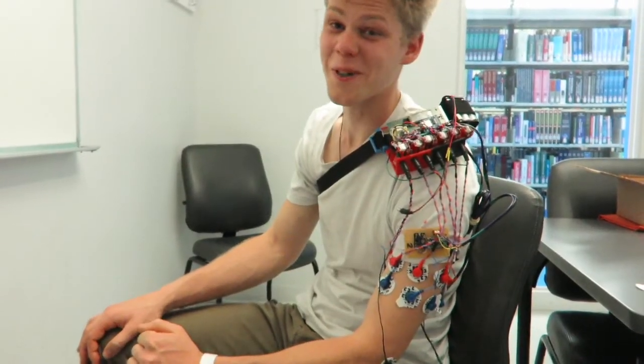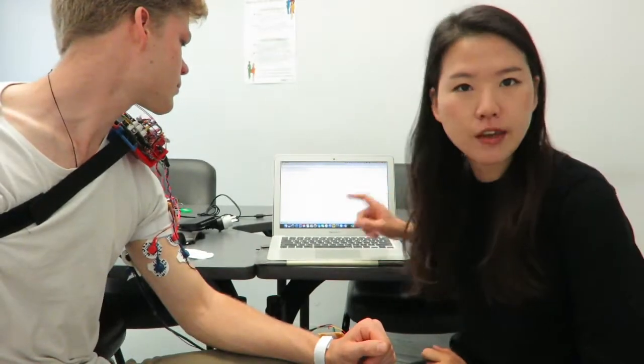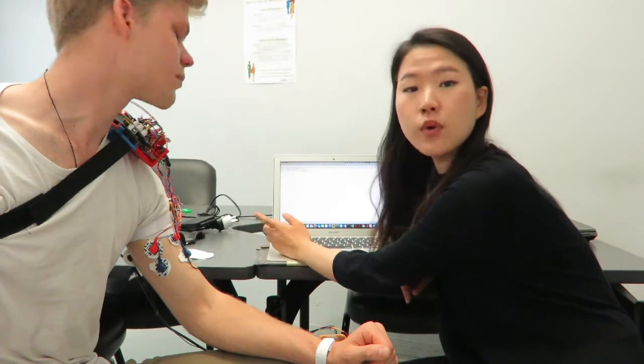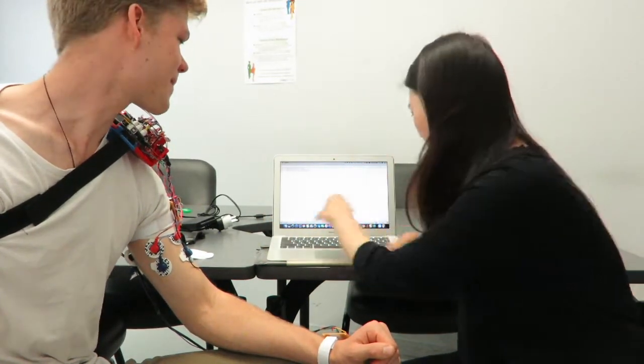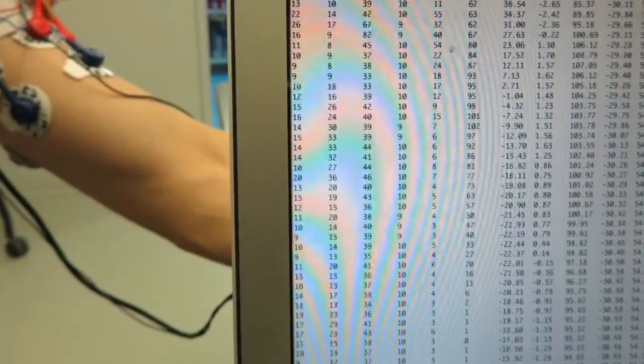Now we'll show you how it works. If you press 1, the system will start to save the data onto the SD card. If you want to see the data in real time on the serial monitor, press 3. This is how the data looks like.